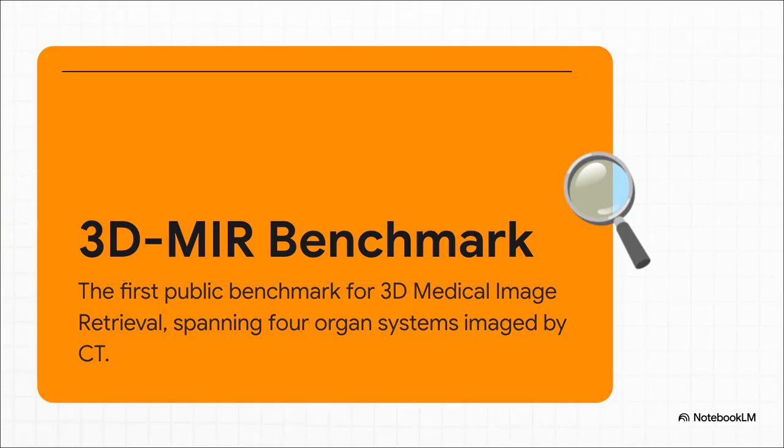And listen, this isn't just any old dataset. It's the first public benchmark of its kind, designed from the ground up for 3D medical image search. It zeroes in on CT scans of 4 really important organs and is built to see if an AI can find not just similar-looking images, but actual medically relevant information inside them.